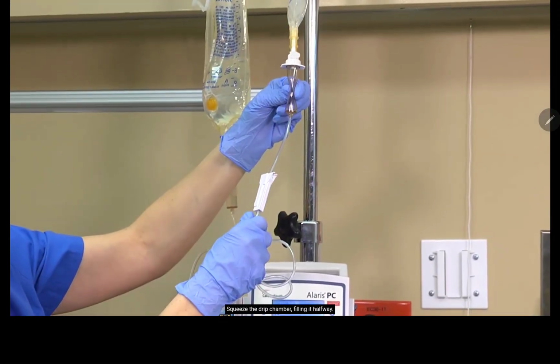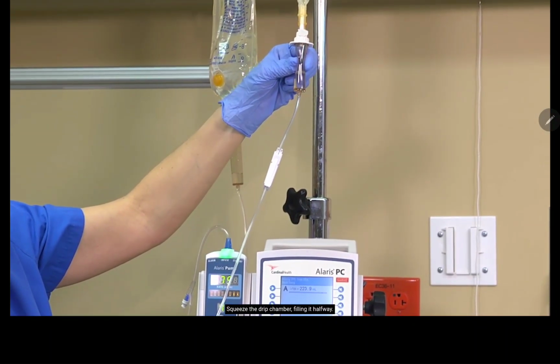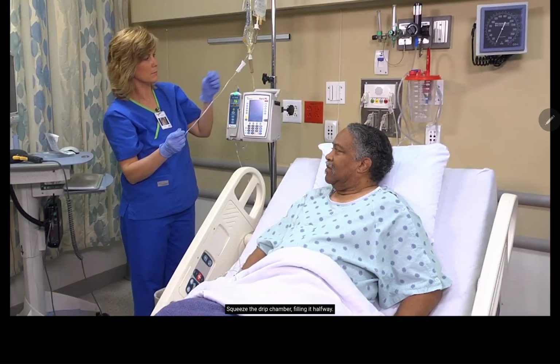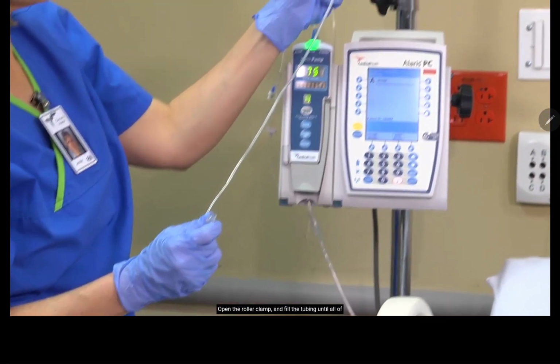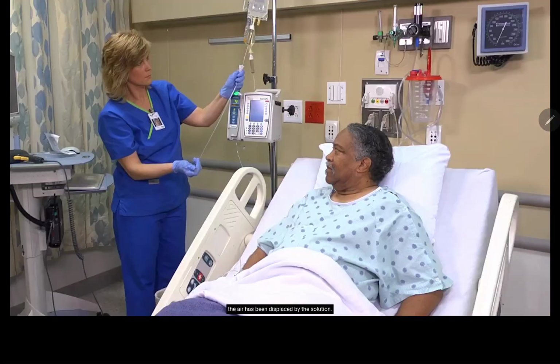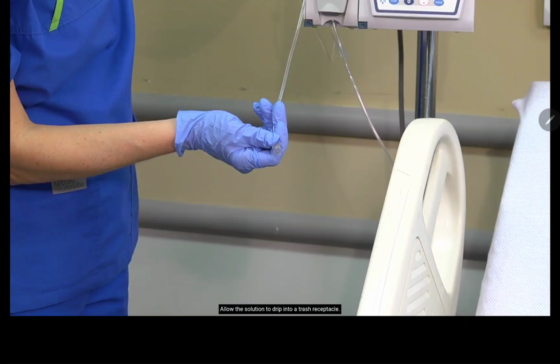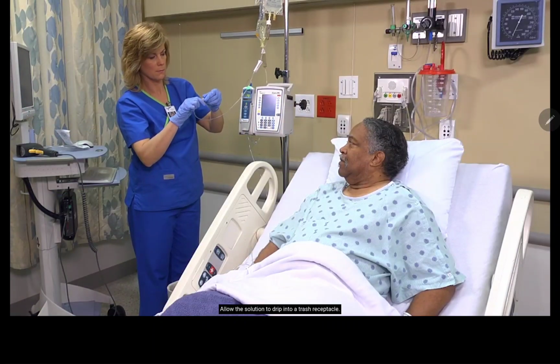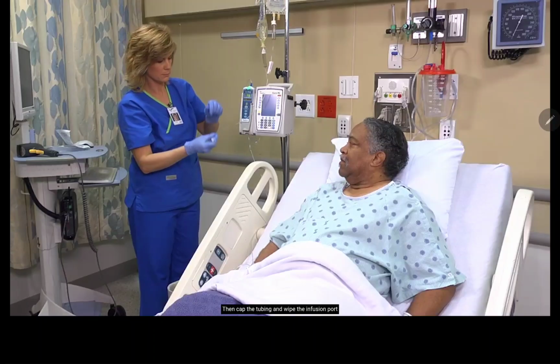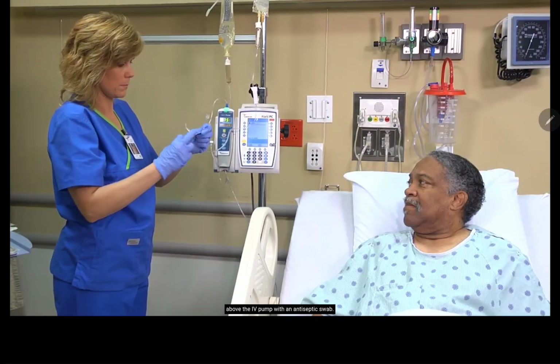Squeeze the drip chamber, filling it halfway. Open the roller clamp and fill the tubing until all of the air has been displaced by the solution. Allow the solution to drip into a trash receptacle. Then cap the tubing and wipe the infusion port above the IV pump with an antiseptic swab.